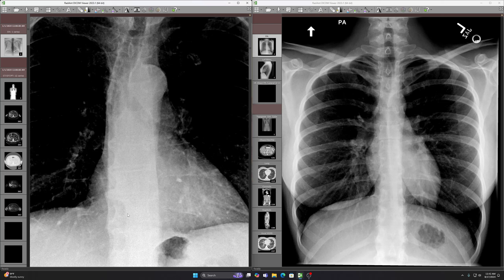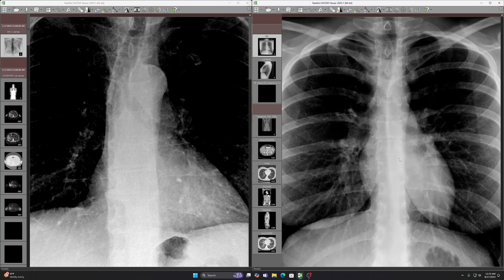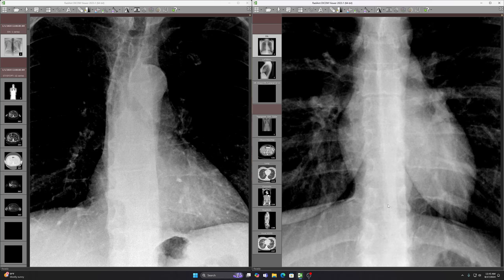This is the azigoesophageal line, which is the interface between the right lower lobe and the mediastinum. Normally the azigoesophageal line is in the midline and it goes all the way up to where the azygos vein drains into the SVC right above the right main bronchus. But in this case you can see that the azigoesophageal line is displaced to the right and there's this contour abnormality right here. On a normal chest x-ray the azigoesophageal line goes up in the midline and you can see it all the way up to the right tracheobronchial angle, which is where you see the azygos vein.